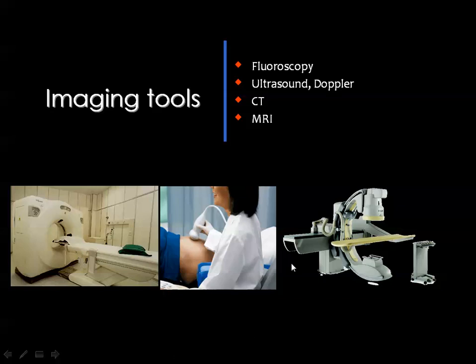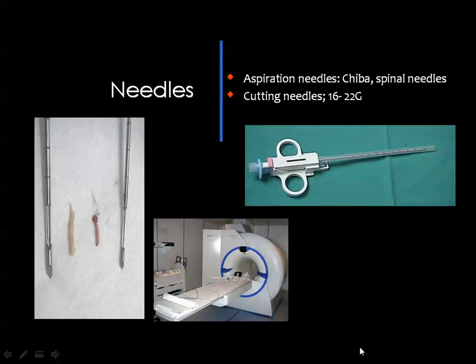And as I have said, I don't have enough experience with ultrasound, so I perform all the techniques using CT guidance. And this is one of the most reliable core biopsy needles available in the market. Here you can see different lengths of the needle, and you see the graded scale on the needle itself to know the distance where you are putting the needle inside the human body.